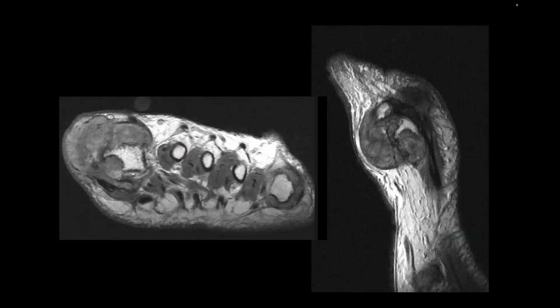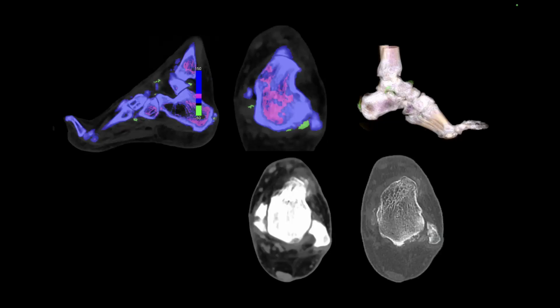Occasionally we get MRIs for gout arthropathy, and sometimes it can mimic soft tissue tumors, and you can see why, with these large areas of tophus that form. In this case it's more obvious because it's centered on the joint, but sometimes it can just deposit in soft tissues adjacent to a joint, and you have to keep that in the back of your mind. Here you can see these large erosions forming around a joint, so the diagnosis is pretty easy on MR in this case.